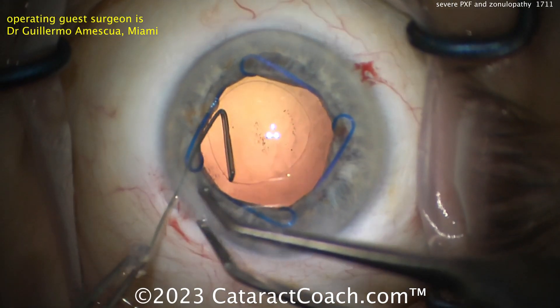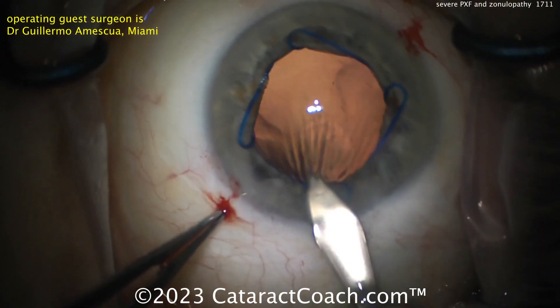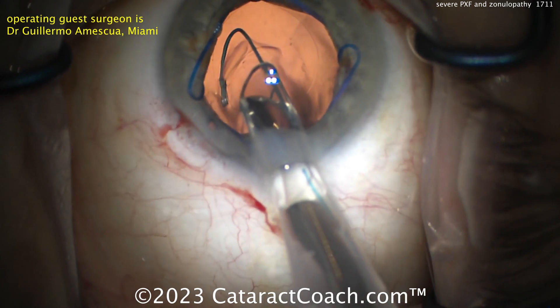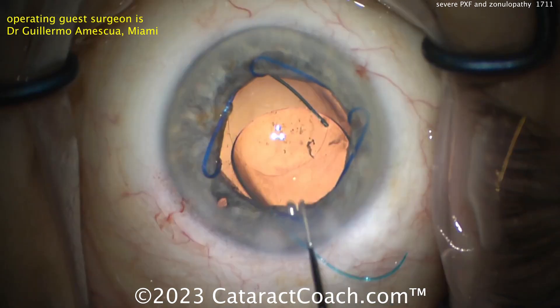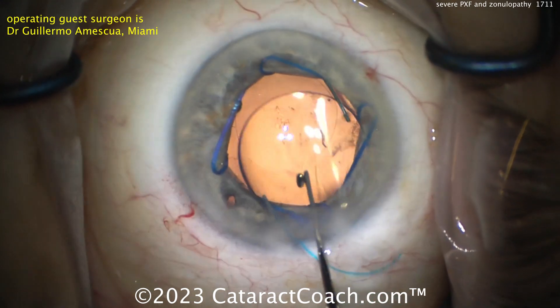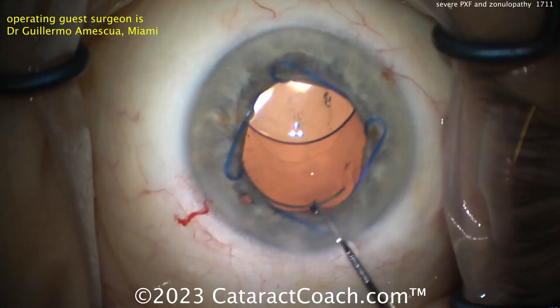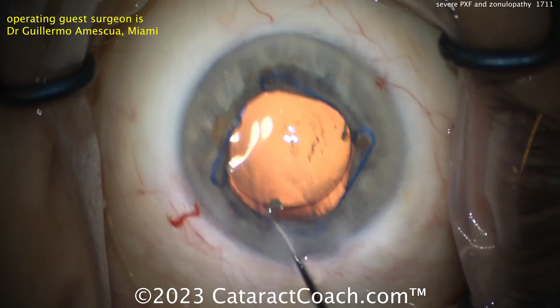For the lens, this is not going to be tremendously stable — it's going to have a lot of motion or movement. That's why I like a three-piece: haptics in the sulcus, optic captured. You can put the entire lens in the bag, and it looks like that's probably what's going to happen here. I like that it's a three-piece instead of a single-piece lens — that gives us more options for refixation later. Maybe the patient comes back in 10 years needing a suture or a Yamane technique. You can obviously convert, because it's a three-piece lens, so more options, a lot more flexibility, easier to suture in place.